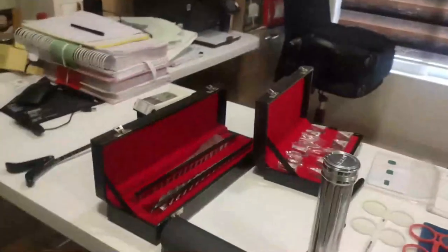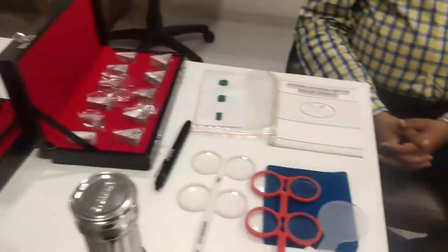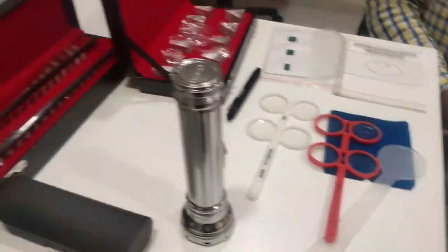Here you can see all the instruments that are needed for evaluating this case. Let's evaluate his binocularity for distance without and with glasses. Please remove your glasses. Look at the dots from the third line below.